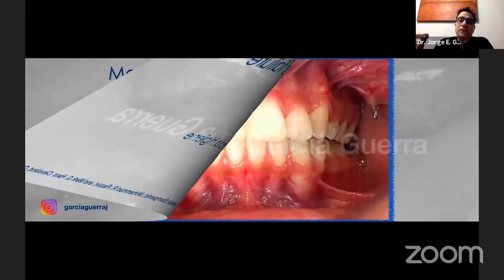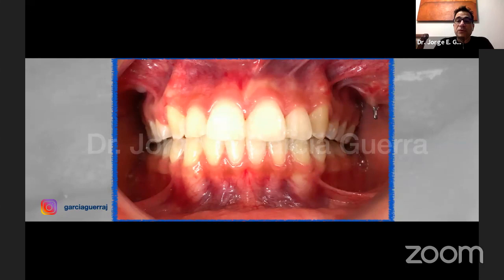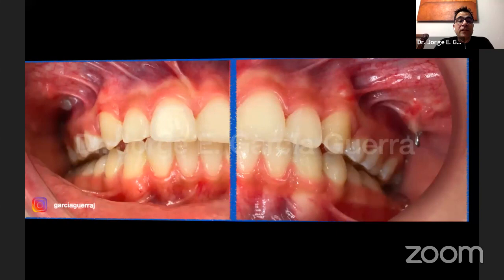We also have this example, a picture a student of mine sent. They just removed the brackets, and you can see those mini implants in the infrazygomatic crest. They were not put in a good site, so they had a lot of movement there. You can see they were just covered by the tissue.